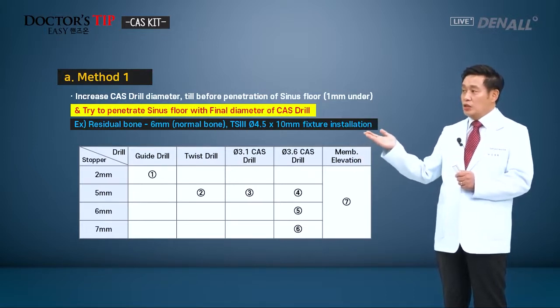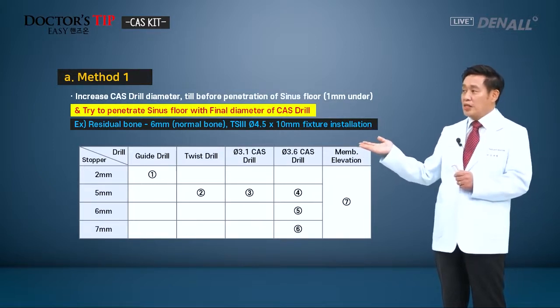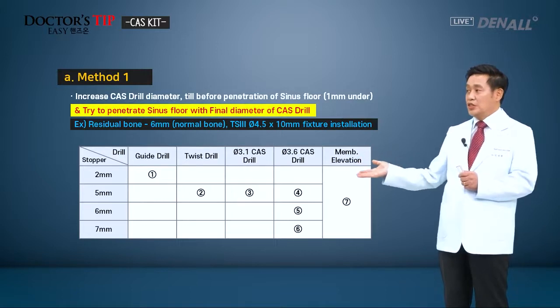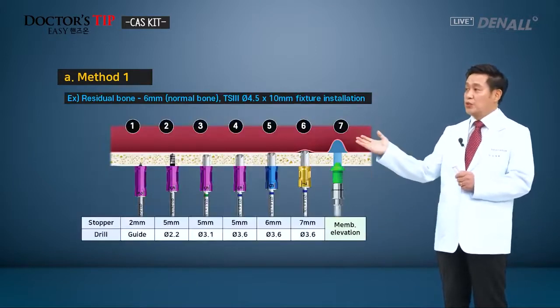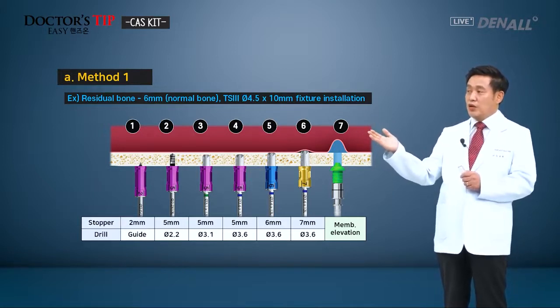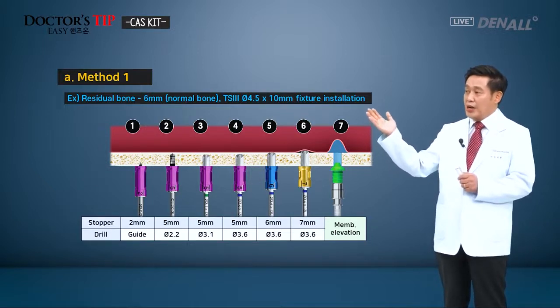First the guide drill, then twist drill 5 millimeters, 3.1 CAS drill, and then 3.6 CAS drill, and 5 millimeter stoppers. So stoppers are changed to advance into the sinus floor. In the diagram, as I said before, if the residual bone height is 6 millimeters in normal bone, with the 2 millimeter stopper, the guide drill is used. Still 5 millimeter high bone remains.